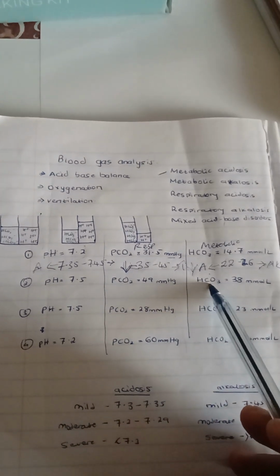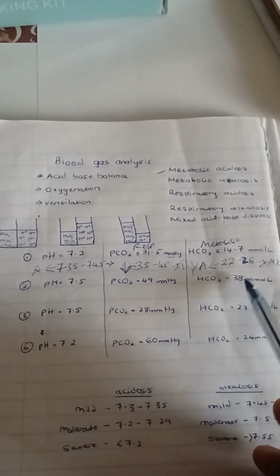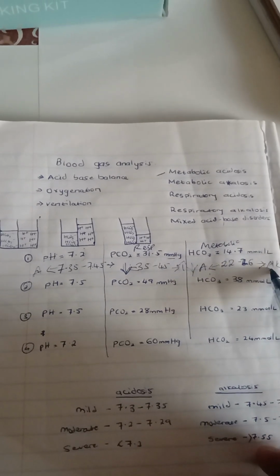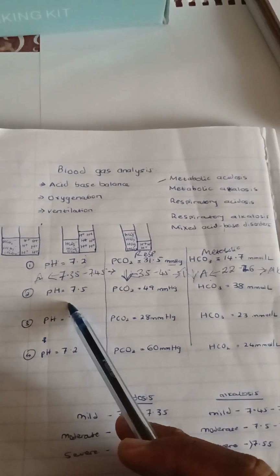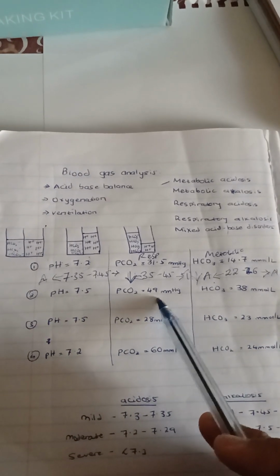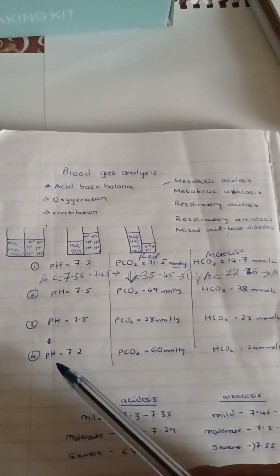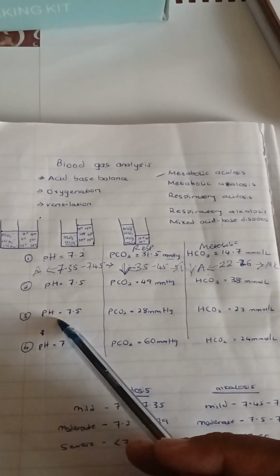We come to bicarb, 38. Normal is between 22 to 26. If it's more than 26, it means it's alkalosis. So it means the primary problem here is metabolic alkalosis. And PCO2 is just rising to compensate for the metabolic alkalosis. Let's come to the third example.